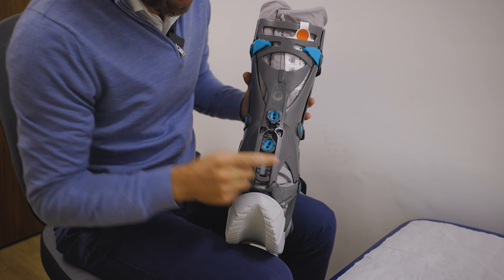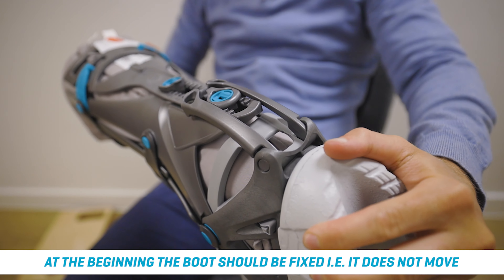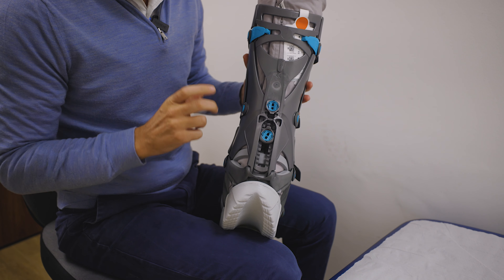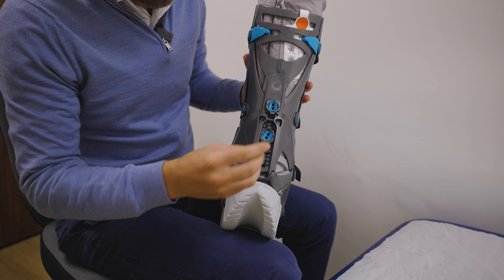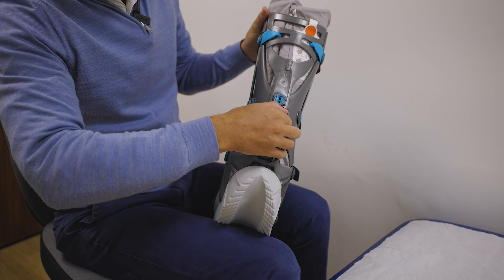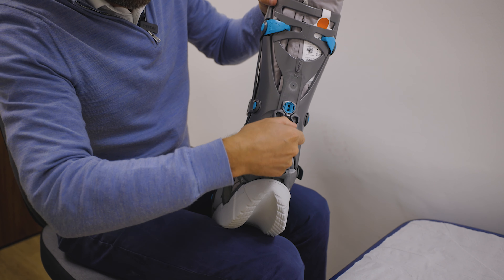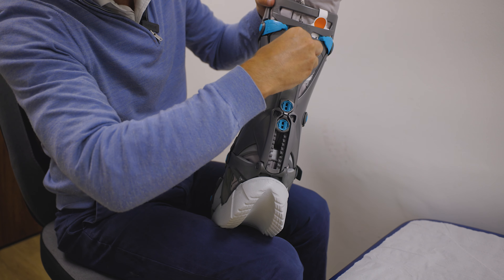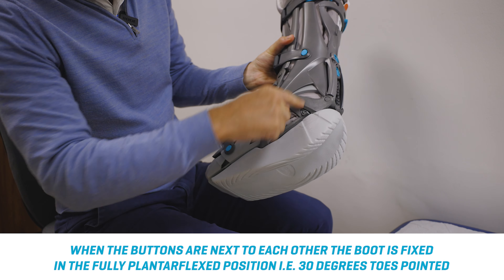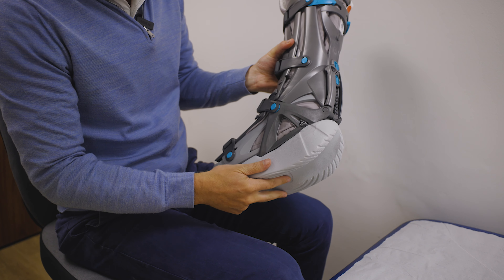Now you can see that's high. Because these two buttons aren't together yet, it's got the ability to move — but at the beginning of your treatment with the boot, you don't want that to move at all. Then take the one at the bottom, lift up, and make sure that the boot is fully plantar flexed so you can see that it is touching the top. It's really locked in there — twist and come out. Now you can see that it doesn't move at all. It's nice and solid and the foot and toes are going to be pointed, giving you the shortening of the Achilles to make sure the ends are together and you're healing well.